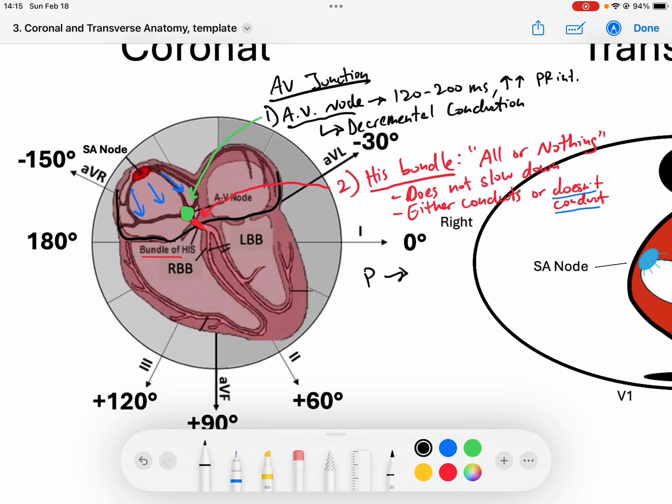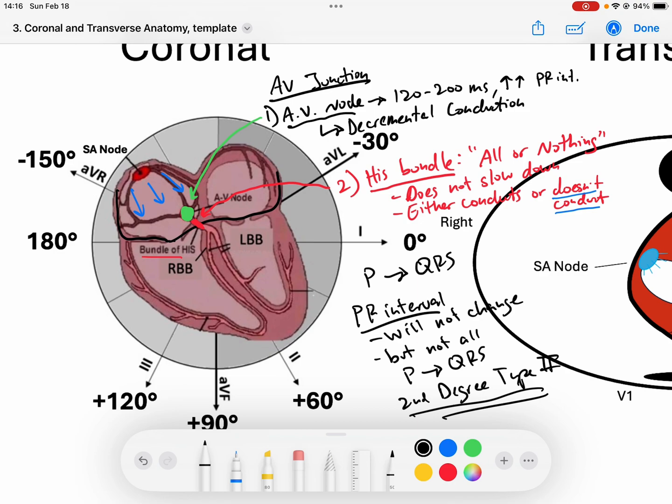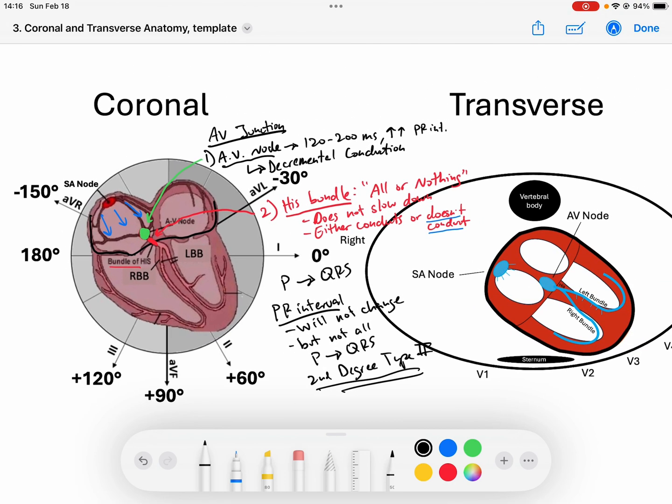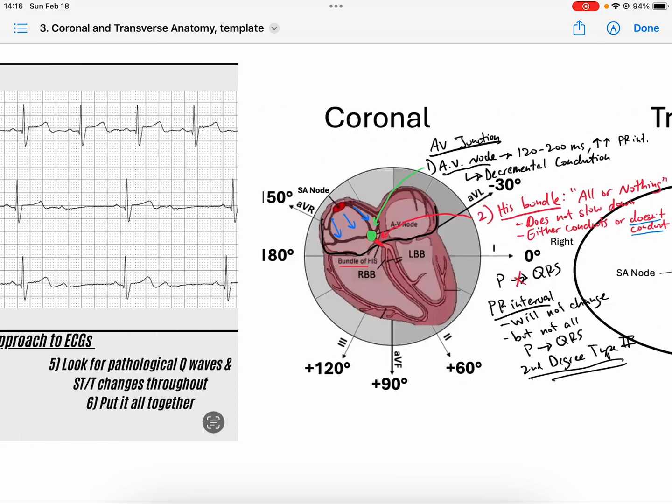When the His bundle becomes diseased, you will see where there are moments that it doesn't conduct. We know that when P waves conduct to QRS complexes, the interval that we measure is the PR interval. The PR interval is telling us what the AV junction is doing. Whenever the His bundle is diseased, my PR interval will not change. The PR interval will not change, but not all P's will conduct to a QRS in a second degree type 2 AV block.